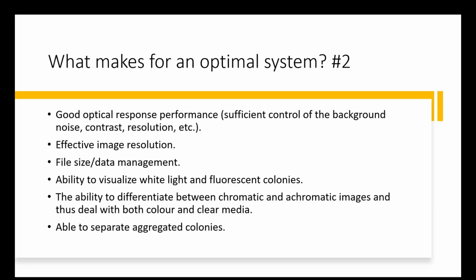So we'll be wanting effective image resolution. This will mean we need to be able to get files of sufficient sizes and have good data management. For the resolution, we also want good sample lighting, and uniformity through the series of images.